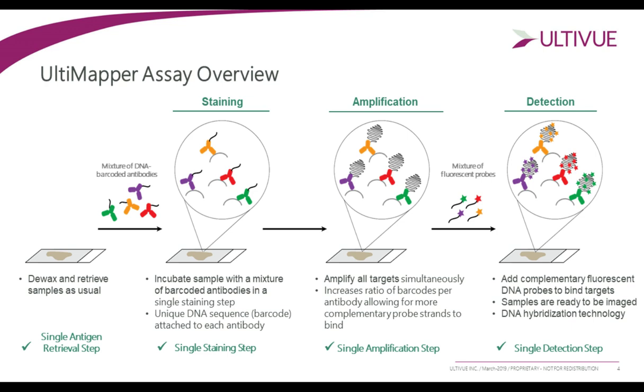a single amplification step. Now, this single amplification step of all targets is incredibly important. This amplification step is a linear amplification method. And all targets are amplified at the same rate and at the same time. And why is this important?